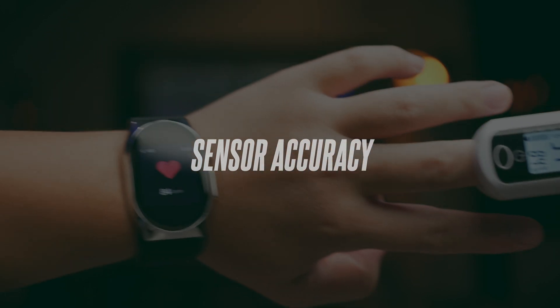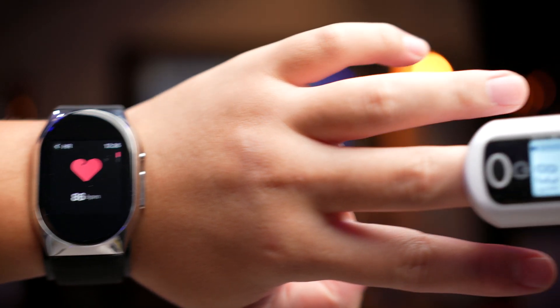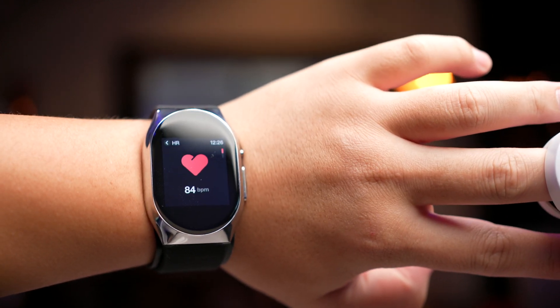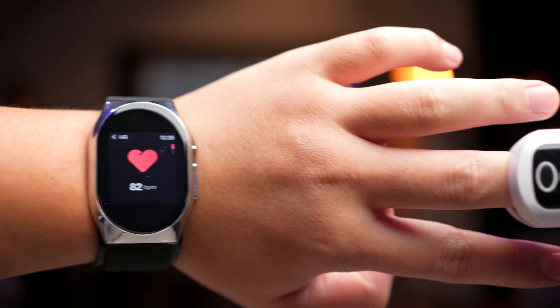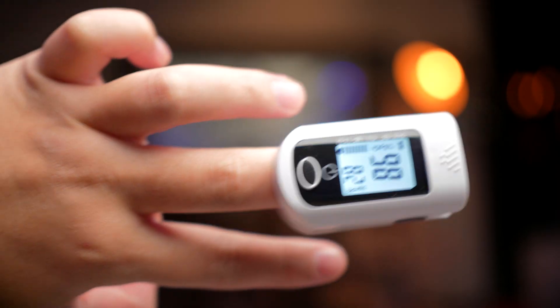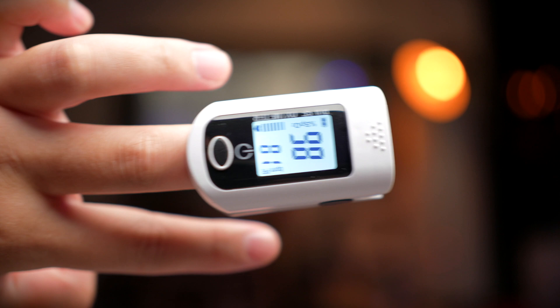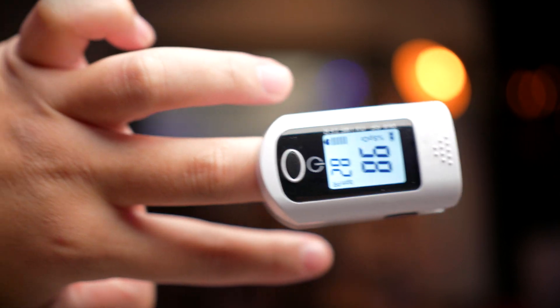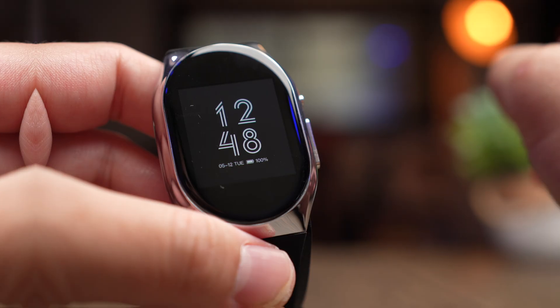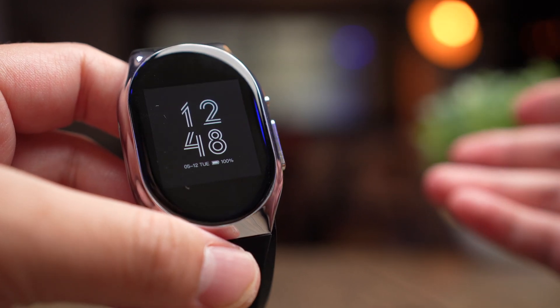In terms of heart rate and SPO2 monitoring, I found this watch to be very accurate compared to an oximeter or my Apple Watch — usually almost on-the-dot accuracy. I also believe the BP monitor is accurate: rested BP readings are pretty much my normal measurement, and it was accurate for my wife as well. I'd like to get a dedicated BP machine in the future to test this more accurately.